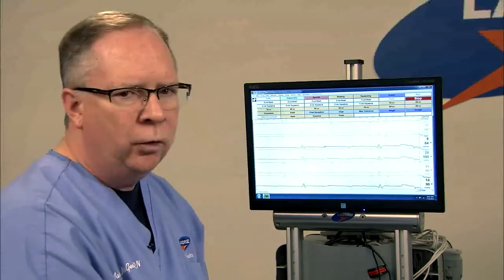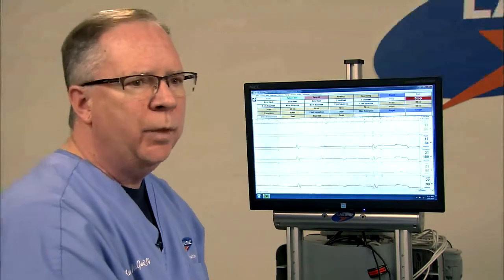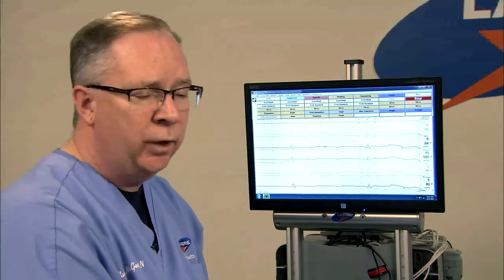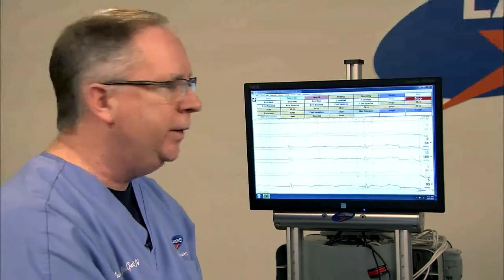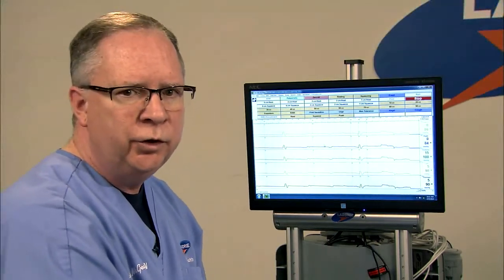Your syringe only holds 60 cc's. You may only want to go up to 60 cc's. Other places may want to go to higher volumes. I've seen one location that went as high as 140 cc's in their balloon. But again, that'll be dependent upon what the physician wishes to do.